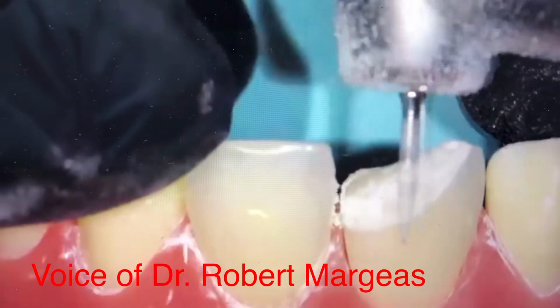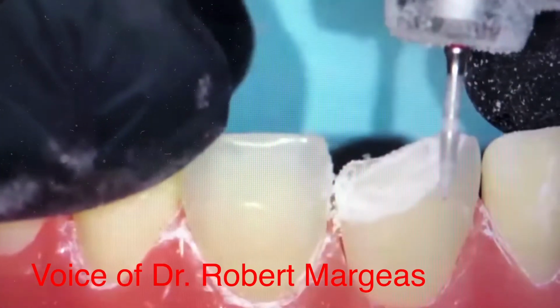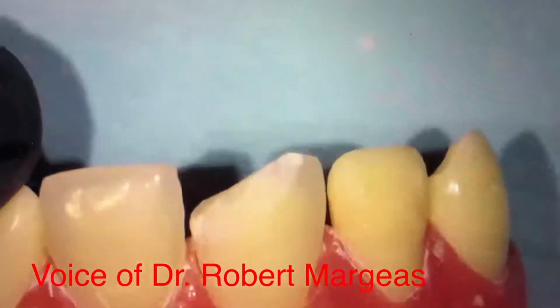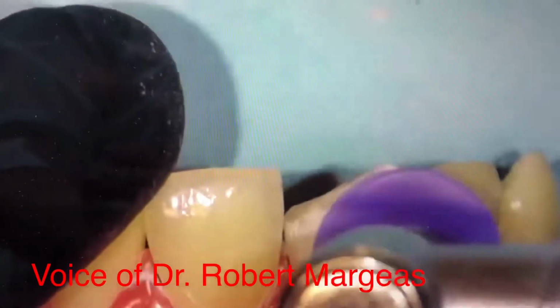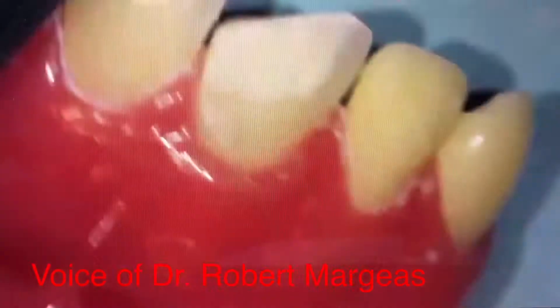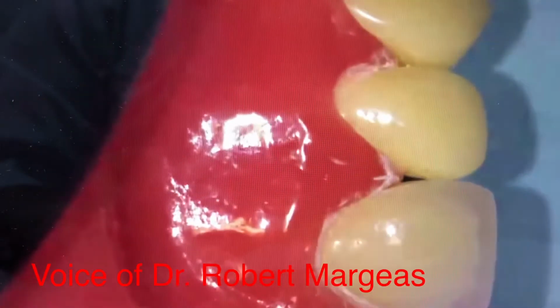And then in order to simulate the etch, what I want to do is this. So you can kind of see what that looks like. You have to over etch the bevel. You don't want to stop the etch on the bevel. You want to etch past the bevel. So I'm going to just take this and roughen this up a little bit so that the material will stick to it. You'll see kind of like a frosty appearance. Okay, it's not really beveling the tooth much, but it's like a frosty appearance.